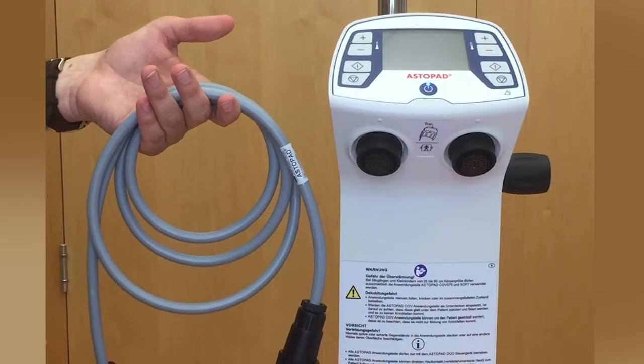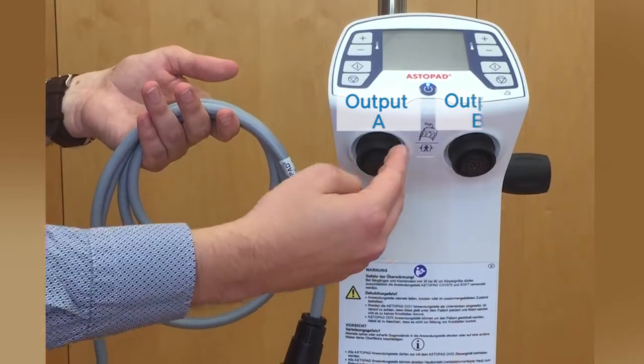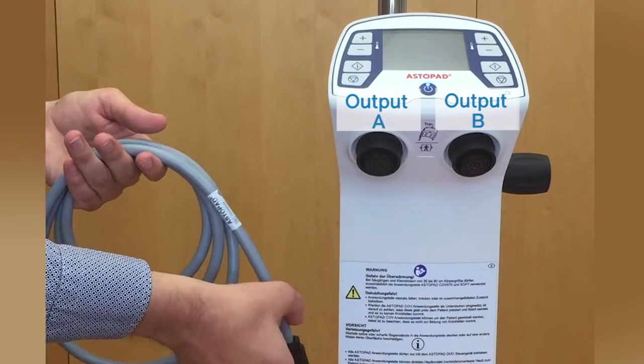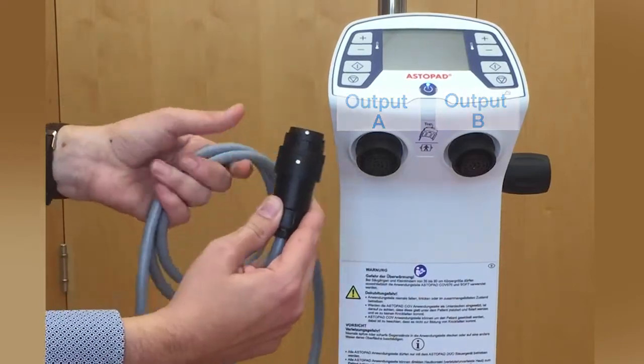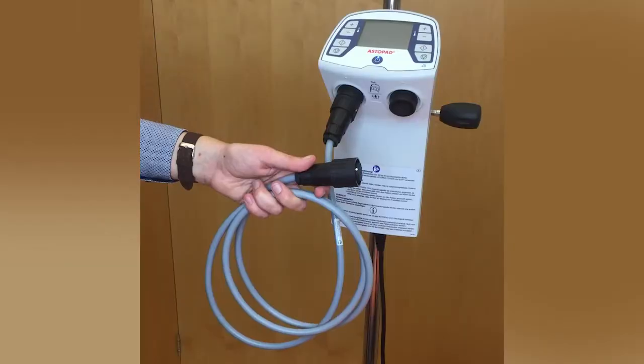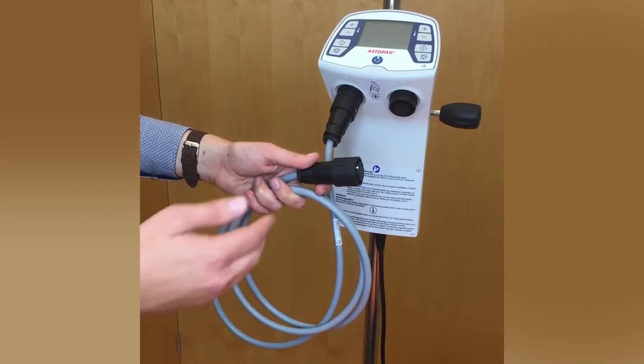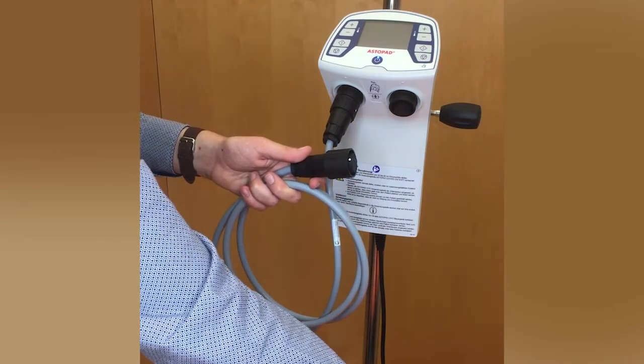Once the blanket is in place, the user can connect it to the control unit. First, connect the extension cable with output A or B to the control unit, then connect the other side of the connection cable to the blanket of choice.